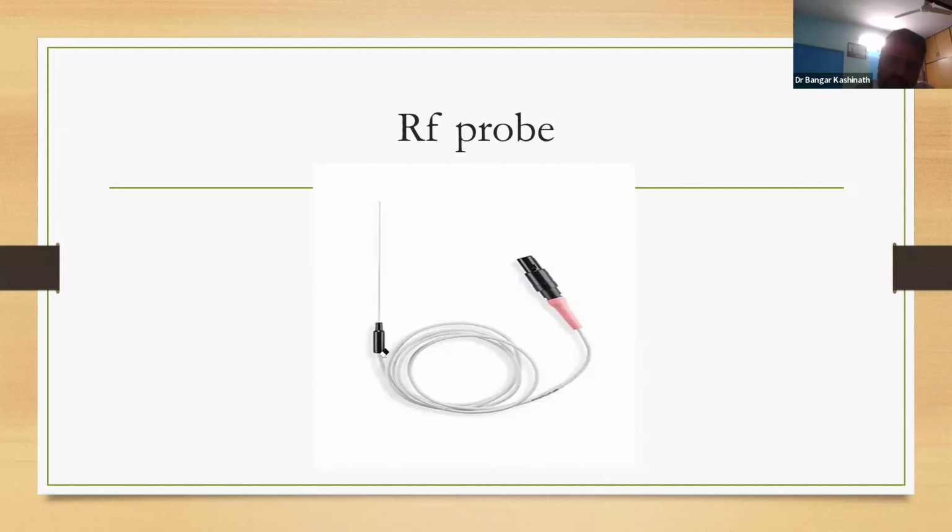Yes, sir. Now it will send back a signal to the machine: the temperature is reached, now don't increase the current or the voltage. Correct? And the machine will stop there. After some time, the temperature will come down to 69 or 68. Again, the thermocouple will see a signal: the temperature started falling, so will the voltage increase or will it remain? These machines are now so good that it remains quite constant at 70. So voltage is not increased, right?